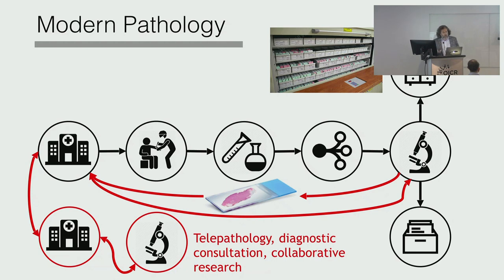It gets packed up, barcoded, shipped, and so on, to get a second opinion from a subspecialist if it is something tough. If it is lung adenocarcinoma, most likely we don't need to do that. That's a common case. There's a lot of expertise on that. But if it is some rare type of cancer, we need to do that. And that's one of the reasons that diagnoses get delayed. A lot of physical transport.